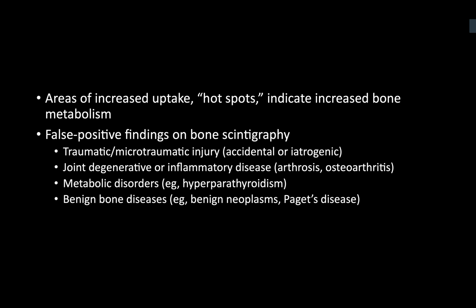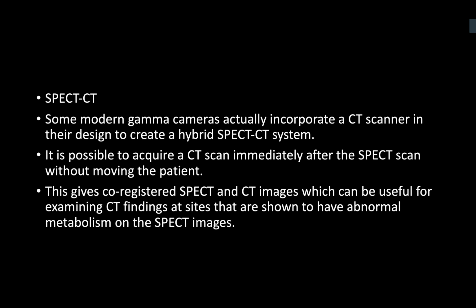The main advantage of this is you will also get anatomical information apart from just the tracer uptake. So it will help us differentiate, for example, a rib fracture, because in the bone scan it will be just taken as a tracer uptake. We don't know whether it's a fracture or not. But if you have the SPECT which is overlapping, you can diagnose even the old fracture.